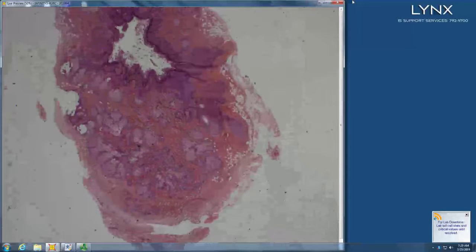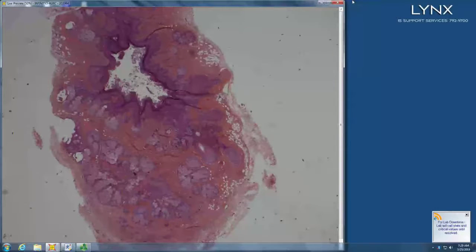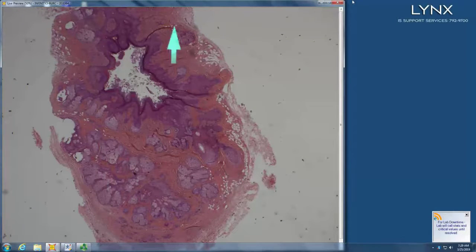Maybe like a dilated pore. Dilated pore, except it has big sebaceous lobules all around it. So I don't see any actual hairs going in there. So maybe a fibrofolliculoma actually, within it. Yeah, there are. So, trichofolliculoma.